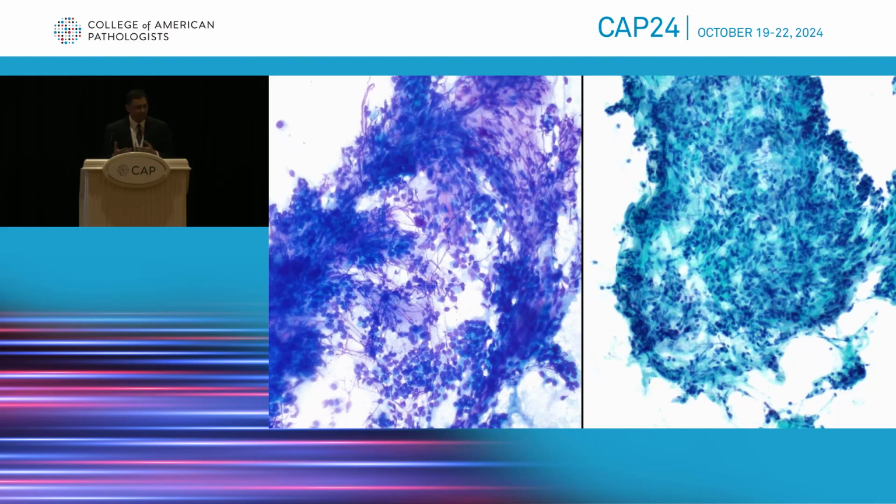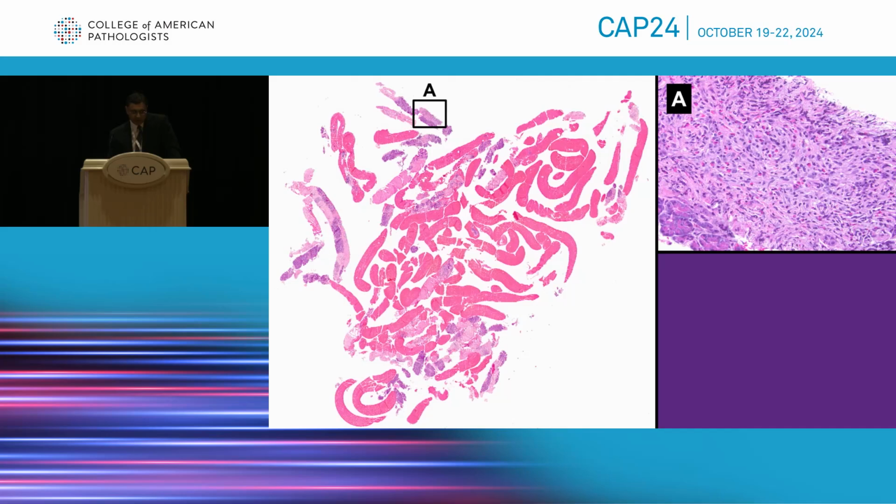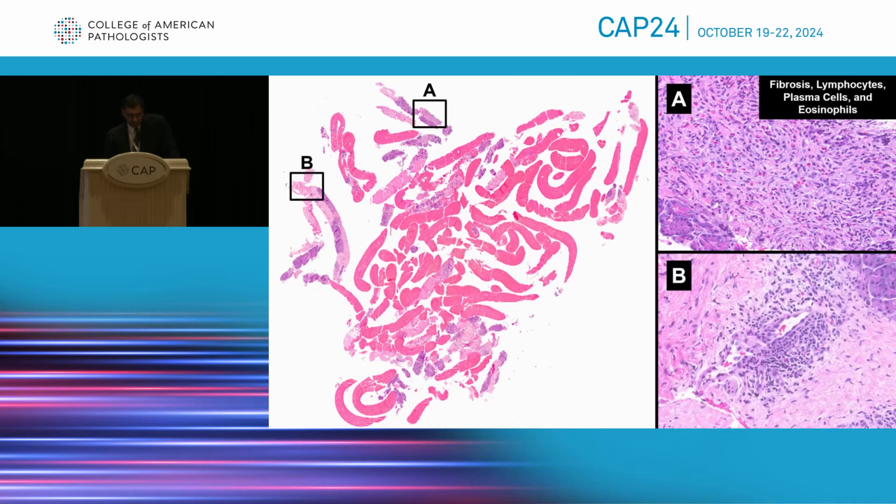really large stromal fragments. An FNB was also performed and yielded multiple fragments of blood and pancreatic tissue, and this tissue is characterized by fibrosis, mixed inflammatory infiltrate that consisted of predominantly lymphocytes, plasma cells, and eosinophils. And in other areas, there was a chronic inflammatory response, emanating from the venous vasculature as opposed to the arterioles within the pancreatic parenchyma.